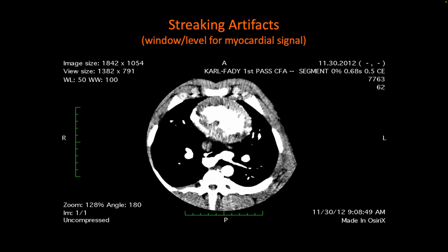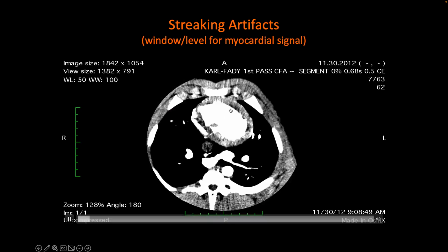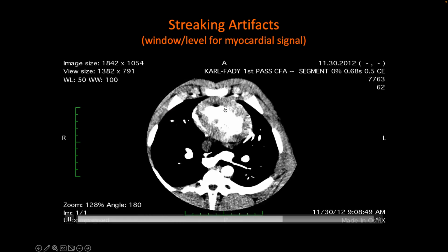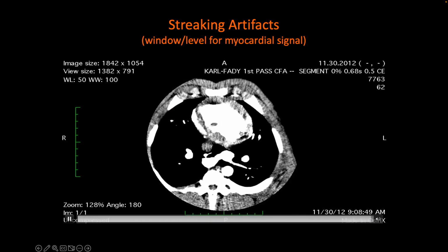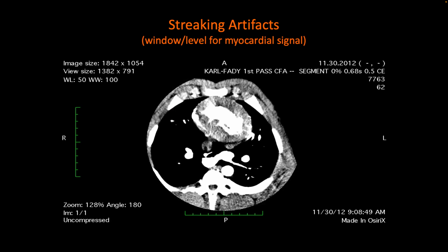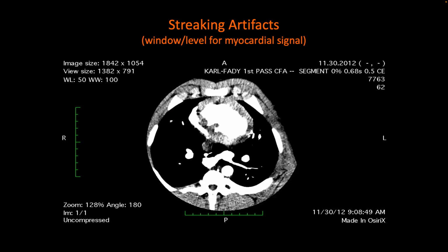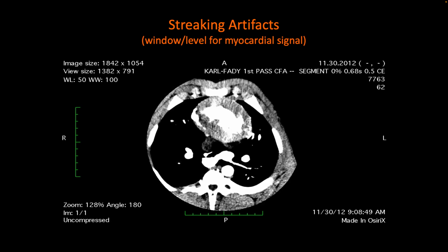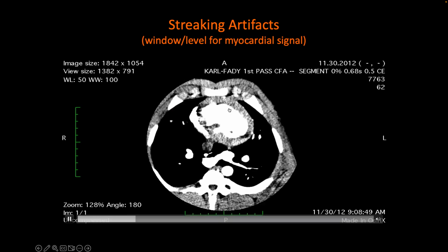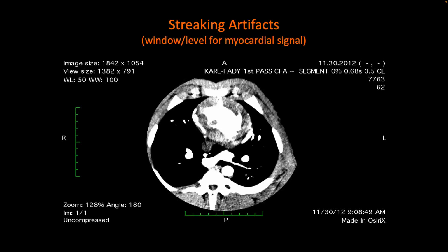Yeah. And the other thing is that we're taking this image over the course of time where we assume that, in any one CT, you're imaging the same object, right? But in cardiac CT, you're not, because as the gantry moves around, the heart is also beating, right? And so you're going to start getting artifacts off of the walls that are moving because it's an inconsistent signal.